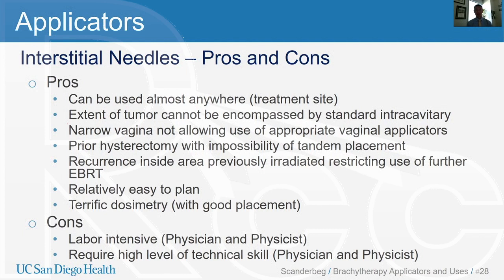However, with good placement, particularly if a template is used, that helps tremendously over freehand. It's often much more straightforward to digitize each needle. So if the implant has many needles that are difficult to identify, then the process can be very, very time consuming and much more difficult.